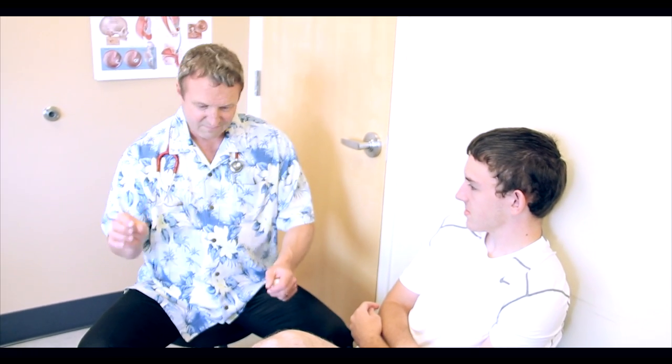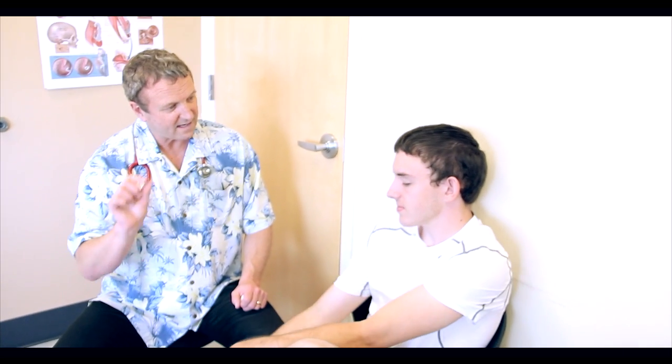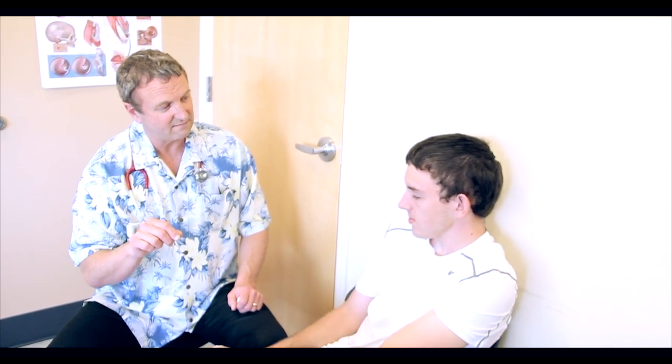After I freeze your warts, you may not like me very well. We've got about a 50-50 chance that this goes away with one treatment. So today, zap it. I may not have to do it again.